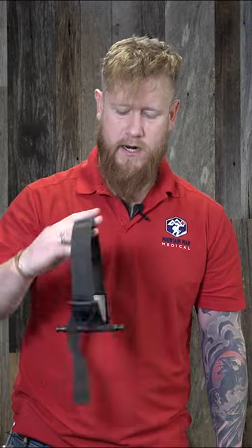We're going to take the tourniquet — we don't have to shake it out because we don't have any hook and loop to defeat here — but we're going to make sure that the tag end is facing across my body so we get the best body mechanics.